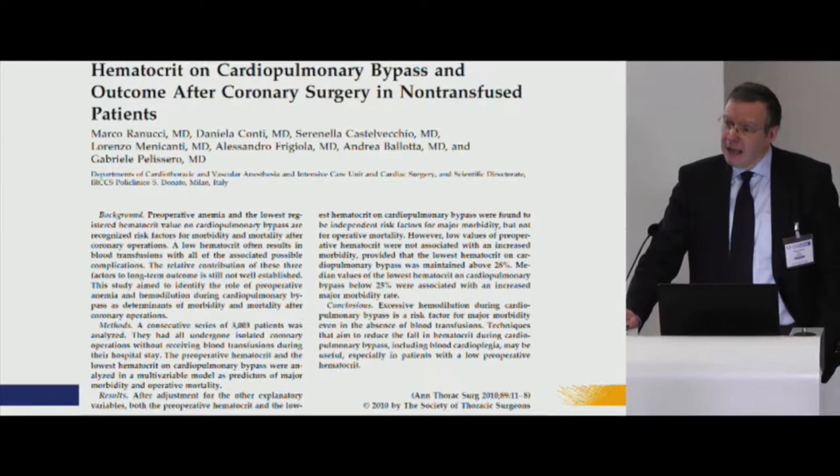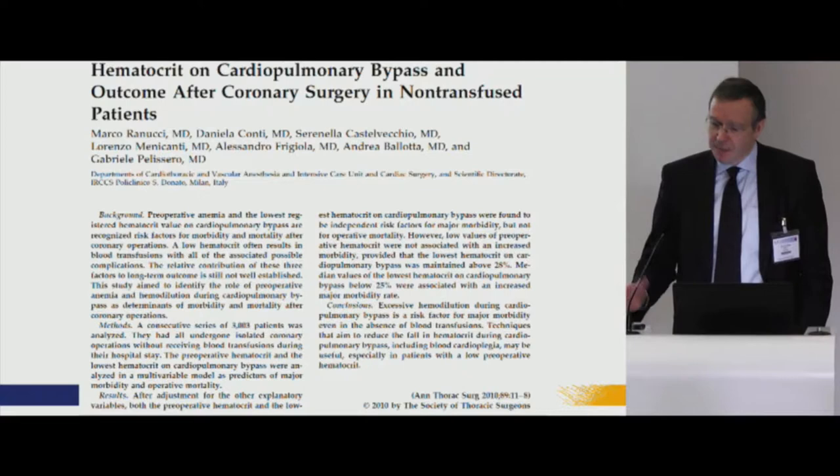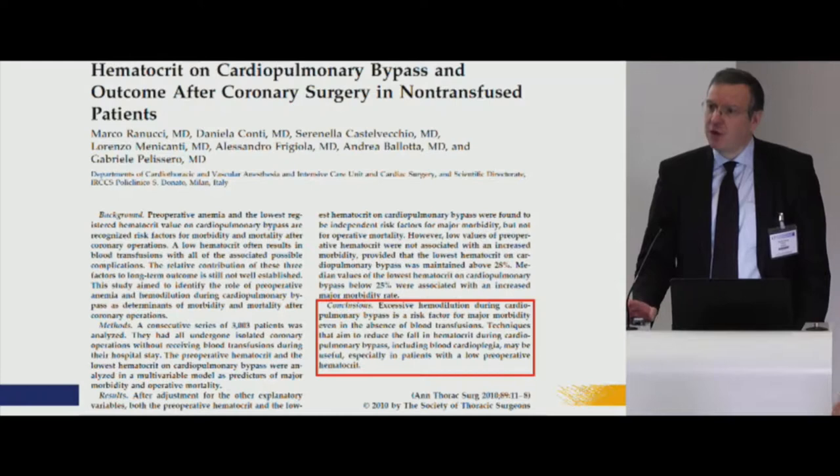Interesting, however, is that we very often are focusing on the priming volume and saying this is the main impact of hemodilution. But I would disagree, because, as we have seen also in the previous lectures, for example, the type of cardioplegia, crystalloid versus blood cardioplegia, has a major impact. But also the amount of volume given before cardiopulmonary bypass, and you would be surprised in some centers how much of this fluid is given, can be a magnitude higher than the total volume given by the bypass system.